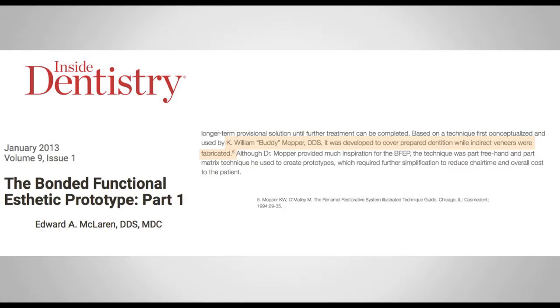And if we use a regular temporary cement, most likely the restorations will debond easily. So Dr. Mopper came up with a very clever idea of spot etching and bonding resin composite on anterior teeth, and being able to use these composites as a temporary restoration.